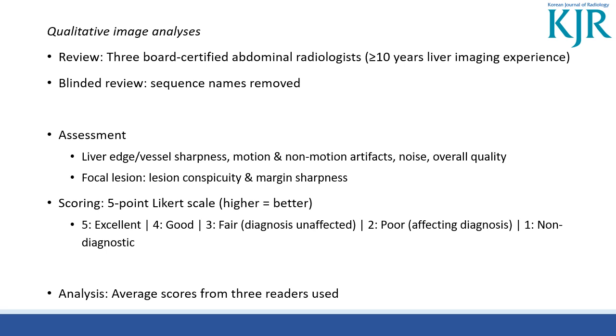For qualitative image analysis, all AMRI image sets were independently reviewed by 3 board-certified abdominal radiologists, each with more than 10 years of experience in liver imaging. Sequence names were removed for the blinded review.